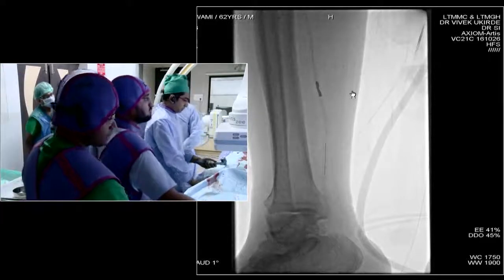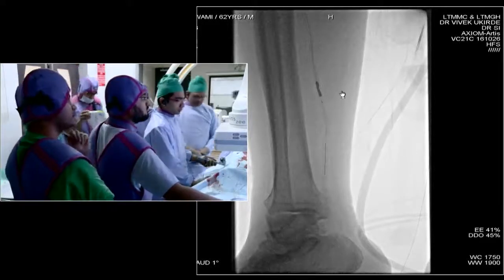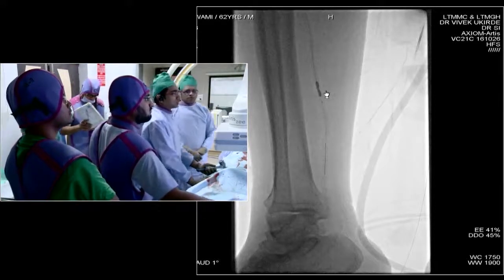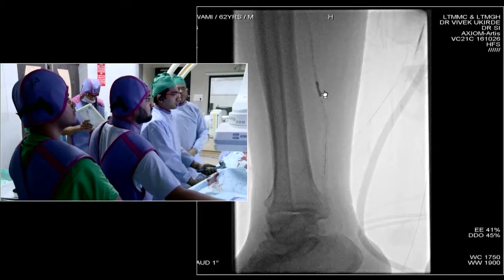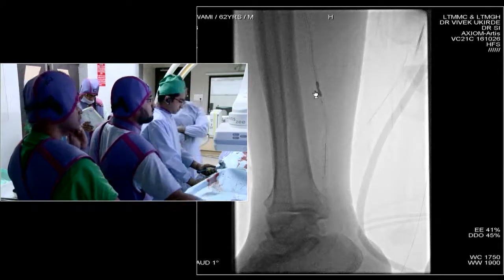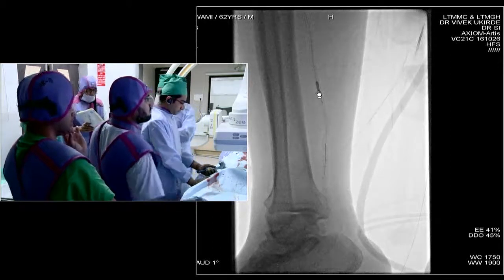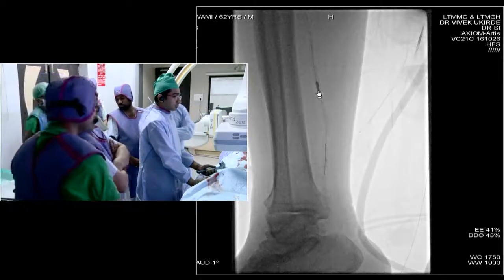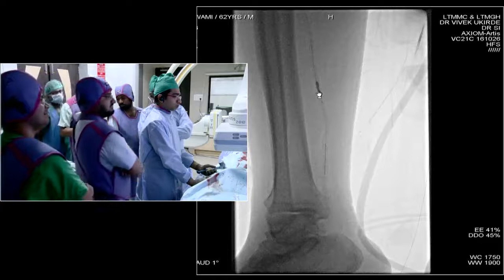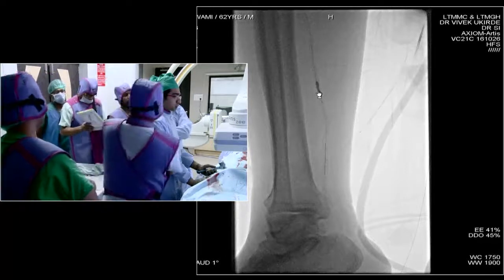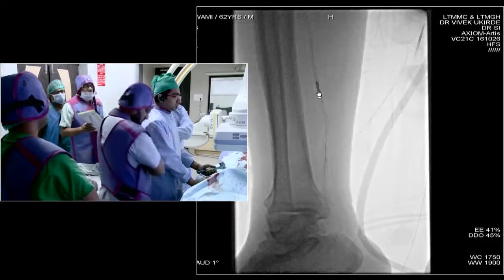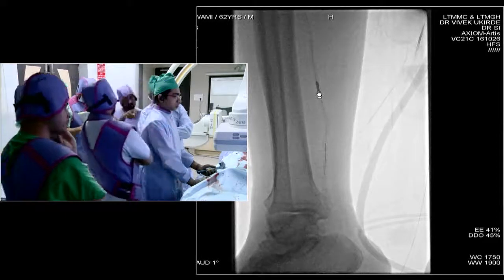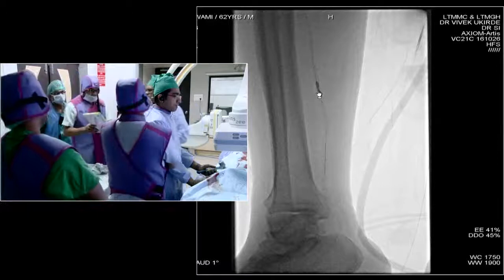So it is very important to prepare the bed — you have to pre-dilate it, prepare the bed, and then get the scaffold and inflate it over there. We are waiting for one minute now, and with the same balloon we can go up to higher pressure.